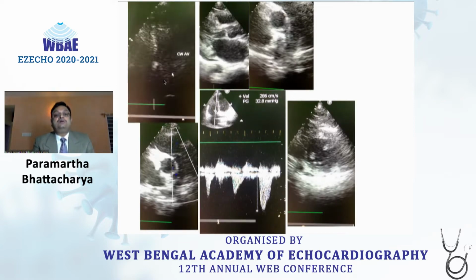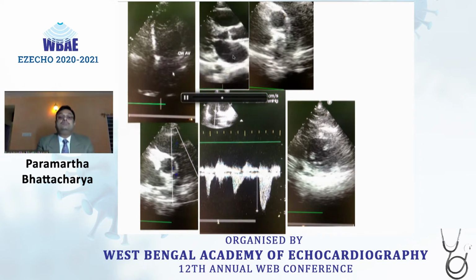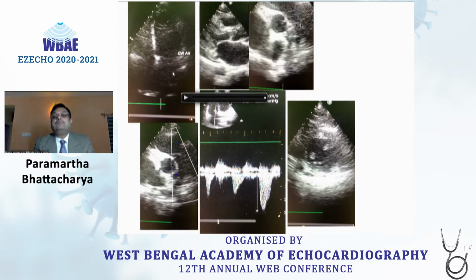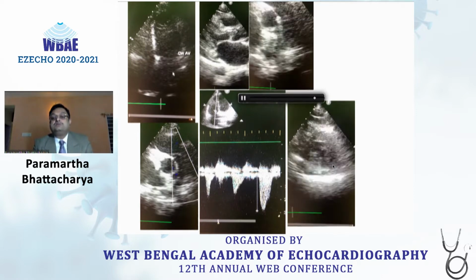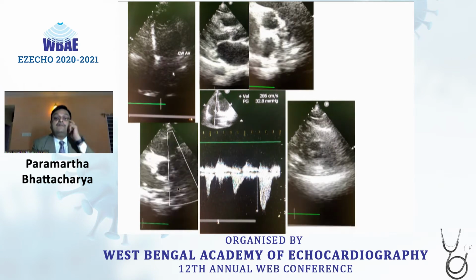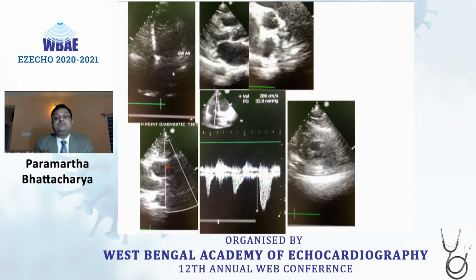See, the patient was in atrial fibrillation. They had a dilated left atrium. There was a chink of pleural effusion. The pulmonary artery was almost normal. The contraction was not that bad. And here you can see the pulmonary artery color flow was also okay. We only saw a tricuspid regurgitation with pulmonary arterial hypertension.